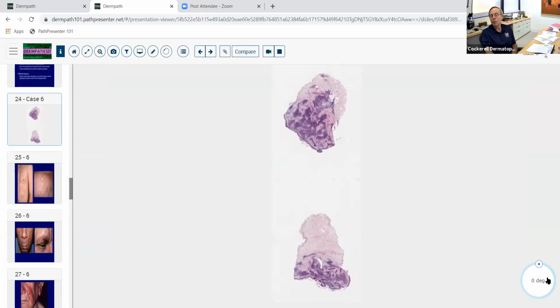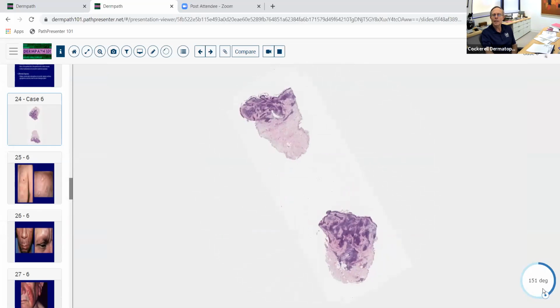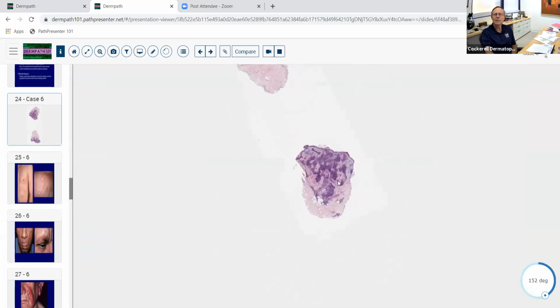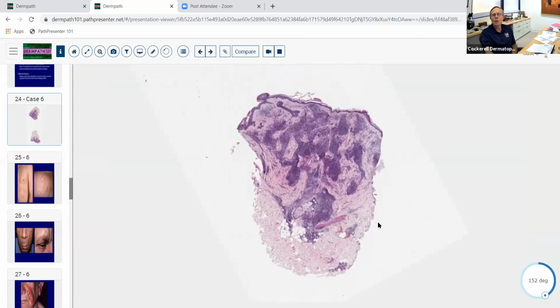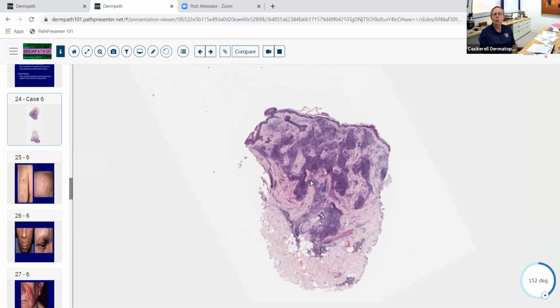This one also could be, let's see here. It's a little bit funky, this slide, but it actually is an interesting pattern. We've had several cases of this disorder just recently, but notice once again we're dealing with a nodular inflammatory disorder. Once again, notice the beauty of the punch biopsy. Shave biopsy here is worthless. You're not going to get a diagnosis. It's a waste of time, waste of money, waste of the patient's visit to you, waste of the insurance of the medical health care system.